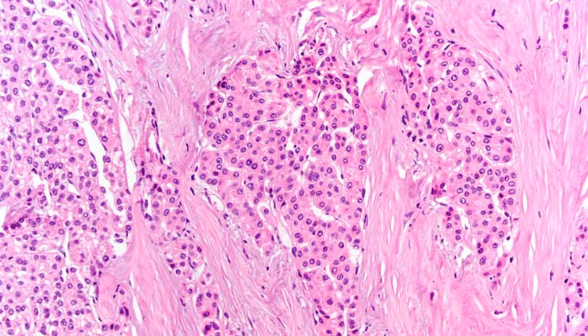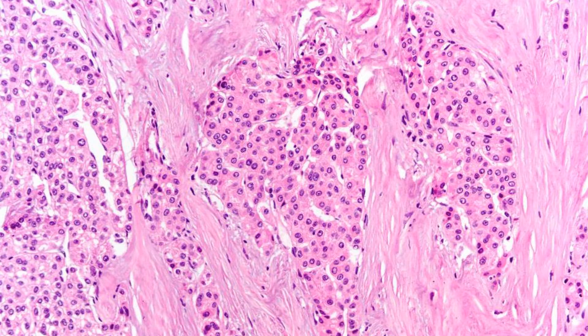This looks like a hepatocellular carcinoma, but it has a lot of stroma in the background. When you see a lot of stroma, think of three possibilities: first, a cholangiocarcinoma, which typically is associated with an enormous desmoplastic stromal response; second, a fibrolamellar variant of hepatocellular carcinoma; and third, a scirrhous carcinoma. Which of these three is this? Wait for the end of the talk.